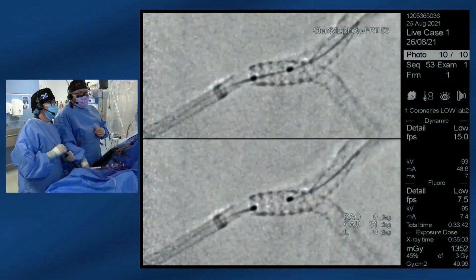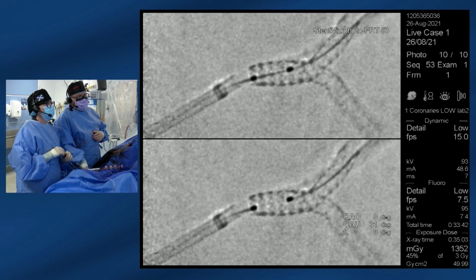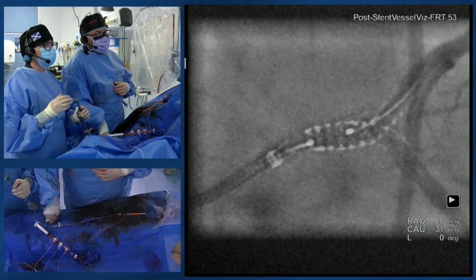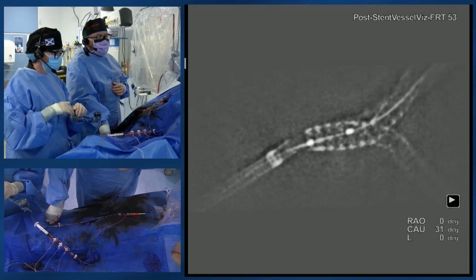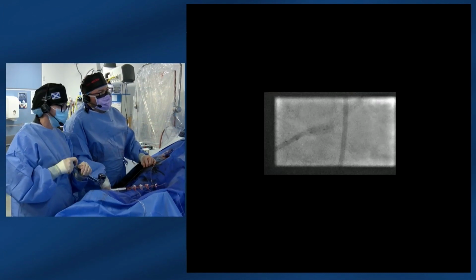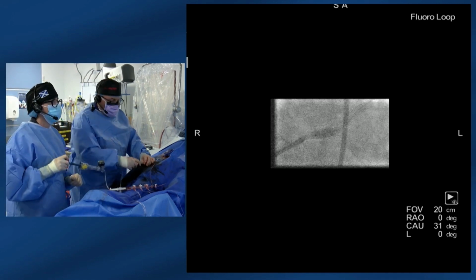You can see there in the StentViz images, the proximal edge of the stent needs to come up slightly. Yeah, perfect position though. You can see here, it's a beautiful stent and vessel viz image, isn't it? And even before our kissing balloons, we've got a fantastic result angiographically on the bifurcation. The carina looks great. So our balloon's in the actual perfect position. So we'll take that 4.5 up for our POT. So that looks nice. You can go 16 somewhere there, that's fine.